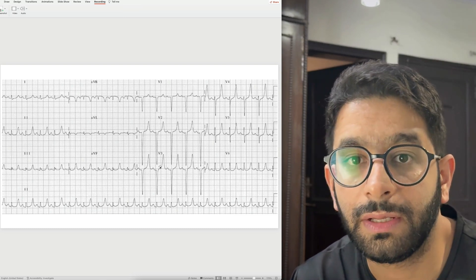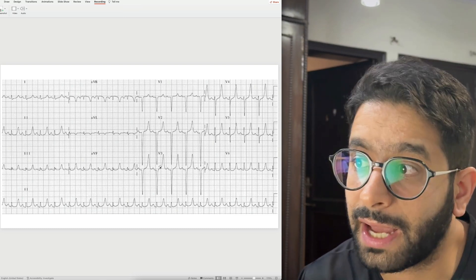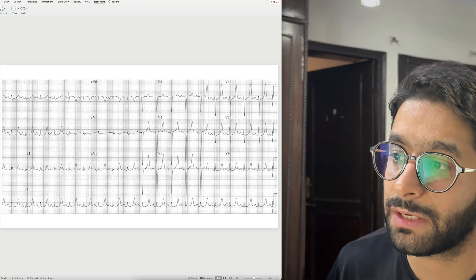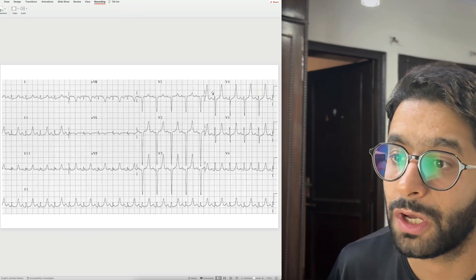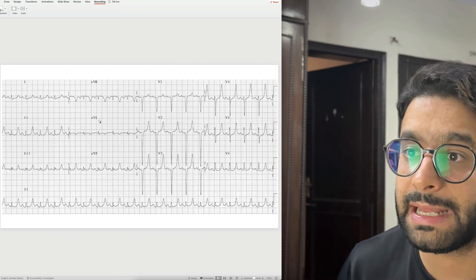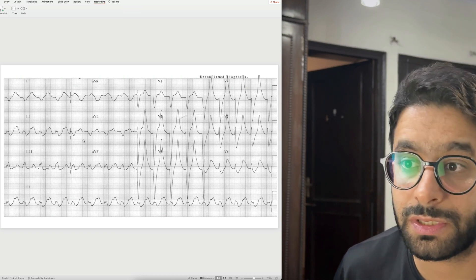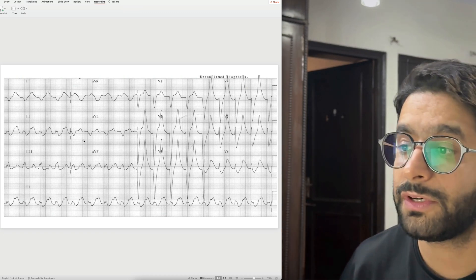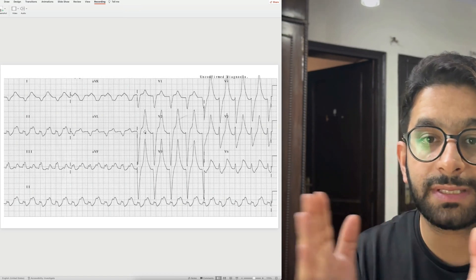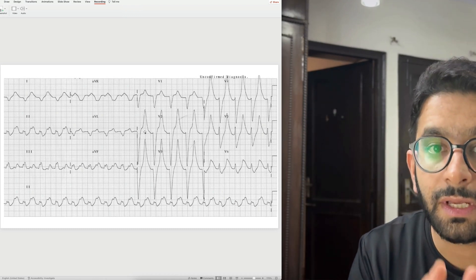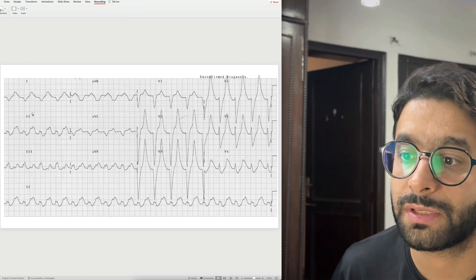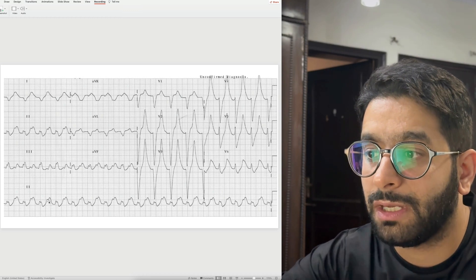The next ECG is something you also cannot afford to miss — if you don't recognize this pattern, it can be hazardous and the patient can die. Here you see characteristic tall, peaked T waves — never normally so tall and peaked. Always remember: tall and peaked T waves point to hyperkalemia and electrolyte abnormalities. If hyperkalemia is not suspected and potassium goes even higher, the next step is QRS starts to broaden and the P wave starts to diminish and may disappear.